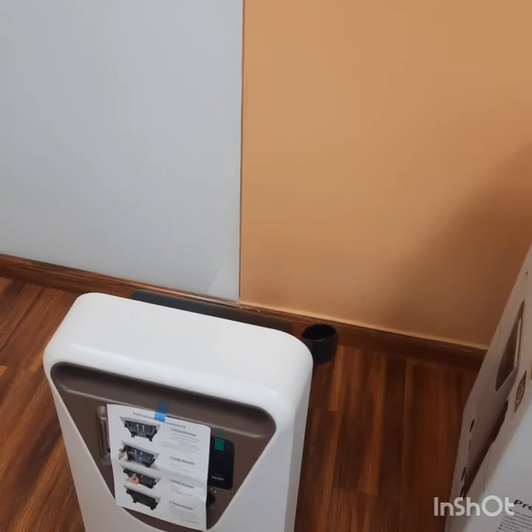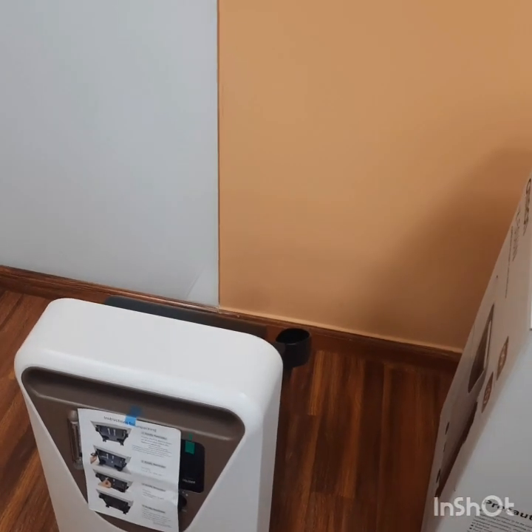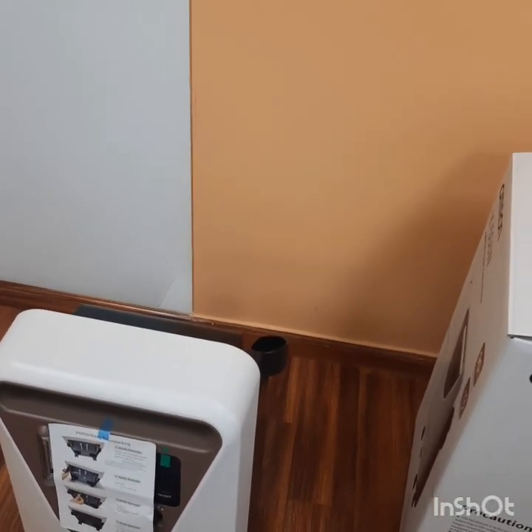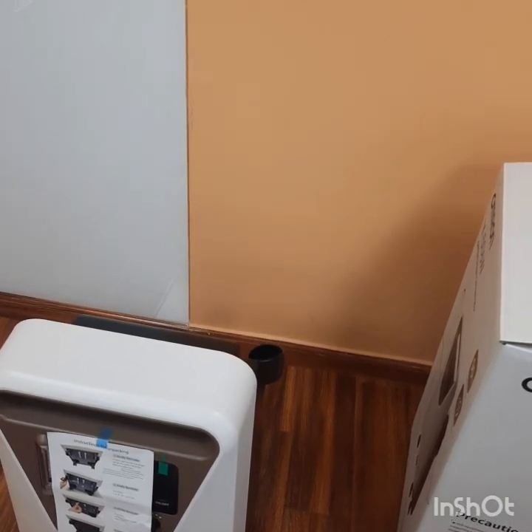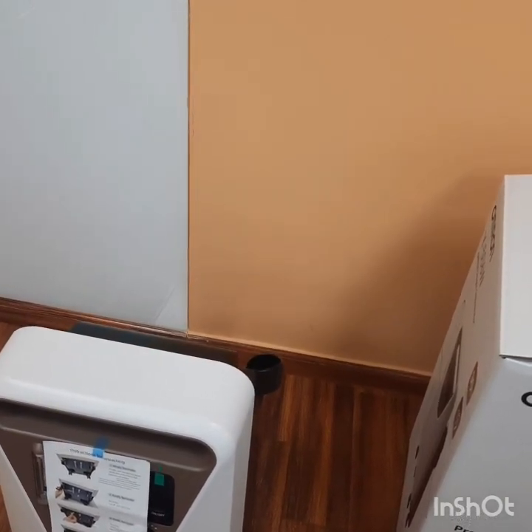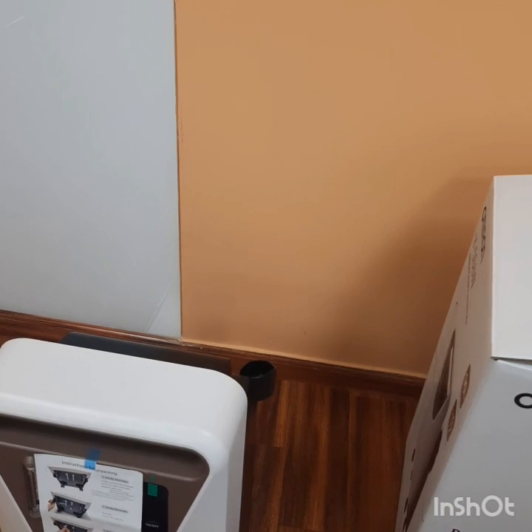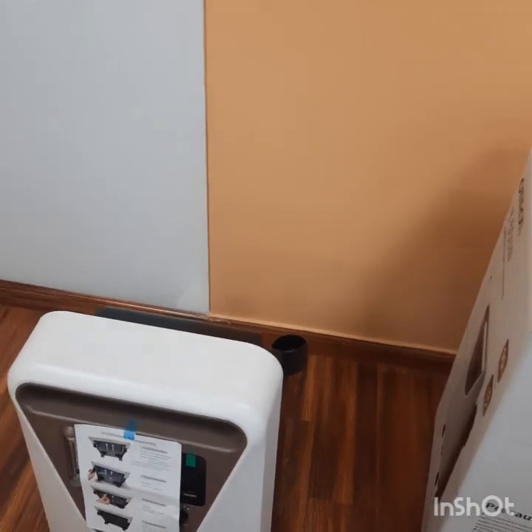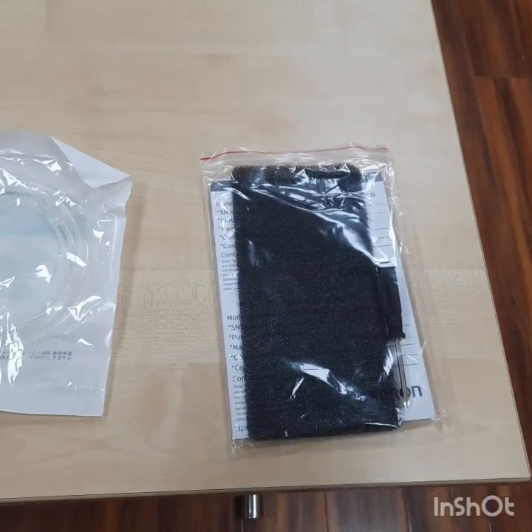In the room where the Oxygen Concentrator is placed, there should be no smoking and no open flames. Do not use oil, grease, or petroleum-based products on or near the Oxygen Concentrator. Also, do not use alcohol, solvent, polishes, or any oily substance on the device.